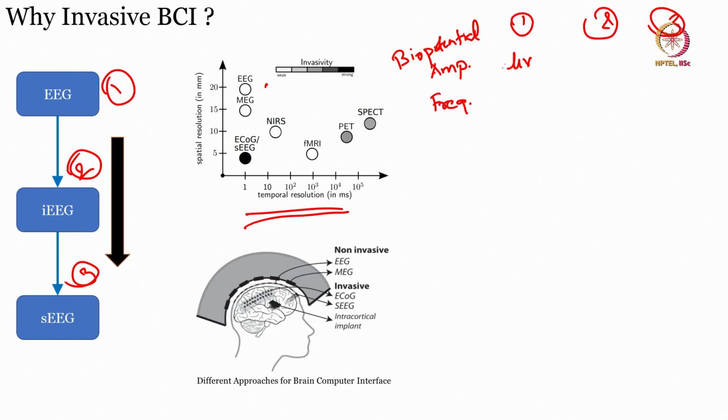There is a response known as ABR, auditory brainstem response. In one of the lectures on hearing screening, the professor would have covered it, or will cover it now. This ABR gives a response of 0.1 microvolt. So you can have an idea how robust the electronics would need to be to faithfully reproduce this signal. Again, there is a combination of hardware and software. The first thing is a very accurate ADC, to get the analog 0.1 microvolt, convert it into a digital signal and transmit it into your system.